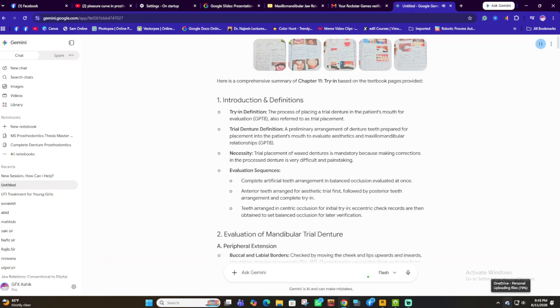Posterior extension is evaluated on the retromolar pad region. Underextension is checked by looking for gaps between the denture base and tissue reflection. B. Stability. Evaluation: pressure is applied on the premolar, molar region on one side of the arch. Lifting of the denture on the opposite side indicates instability, Fig. 11.4. Causes of instability: teeth set outside the ridge or lack of adaptation on the pressure side, or an underextended flange on the non-pressure side.